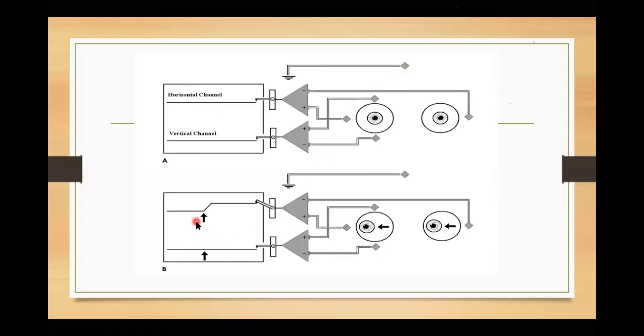Okay. So what happened here? There was a baseline, and since there was a movement, it increased and then it continues. The eye is still looking here. But was there any movement in the horizontal vertical direction? No. So the vertical recorded no movement at all. Is it clear how the ENG works?